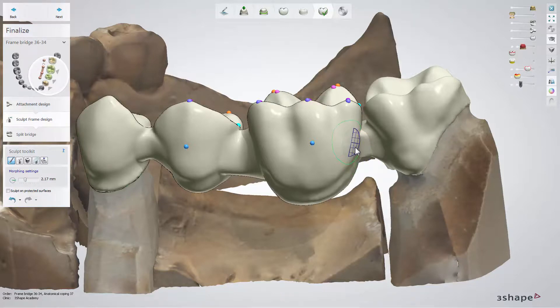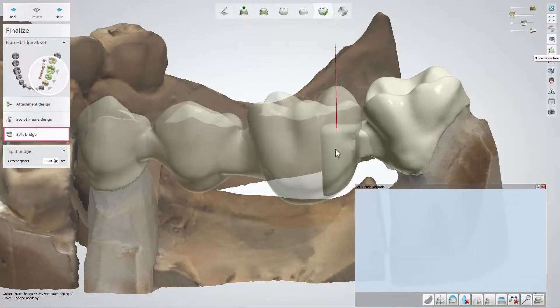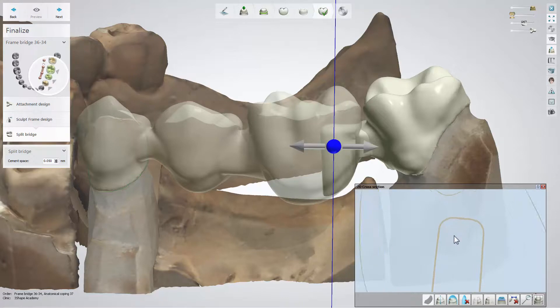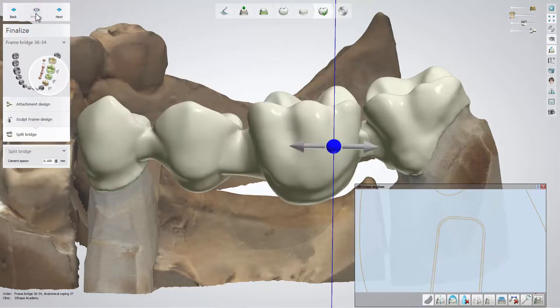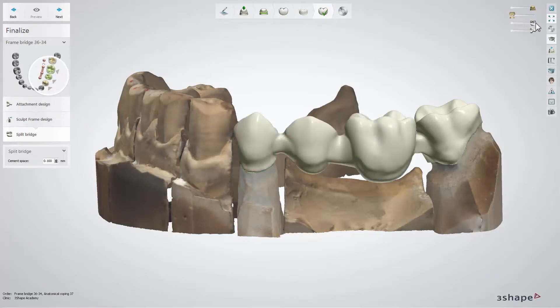If you are satisfied with the design, click Next to go further. The final split bridge sub-step allows you to define the friction between the male and female parts of the bridge. Click Preview to see the changes applied. Remember that the male part always goes first and then you can fit the female part on top. Click Next to go to the save step.